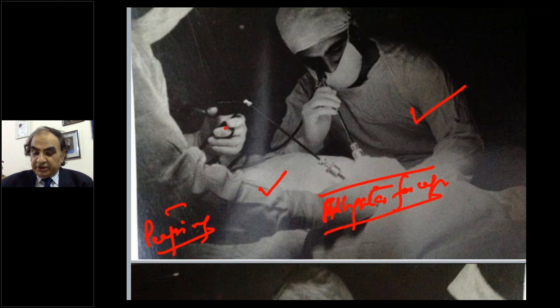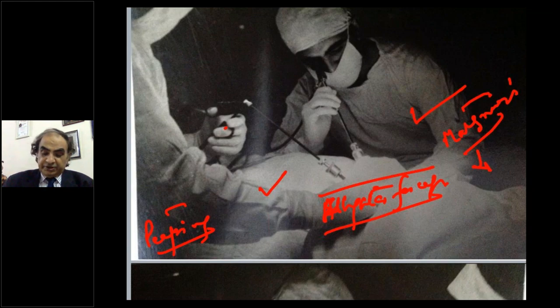So I picked up mostly malignancies which were terminal, and it really was beneficial. I did take liver biopsies at that time, but it's always a challenge. You can see there's no diathermy attached. When taking a biopsy, never attach a diathermy because it will destroy the tissue. So it has to be taken either with cold scissors or nowadays with a harmonic scalpel. Don't destroy it. Most people I've seen cut it with diathermy. There's no point taking that biopsy because the tissue would be all dead.